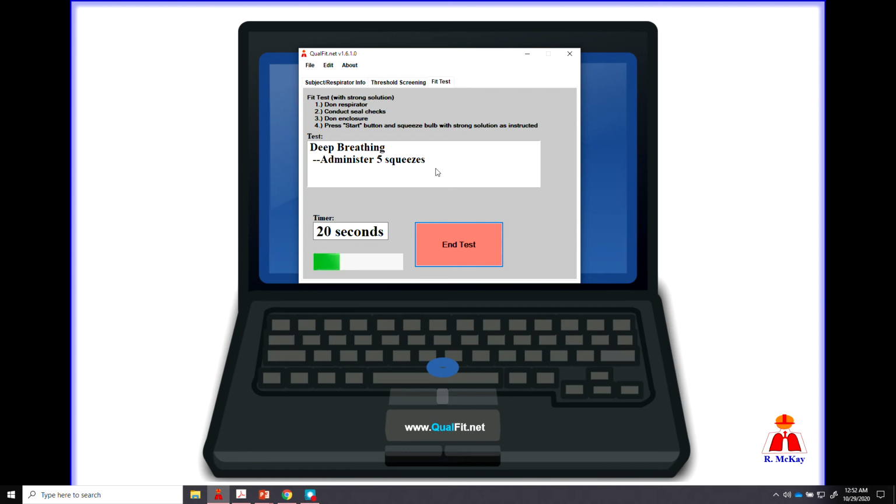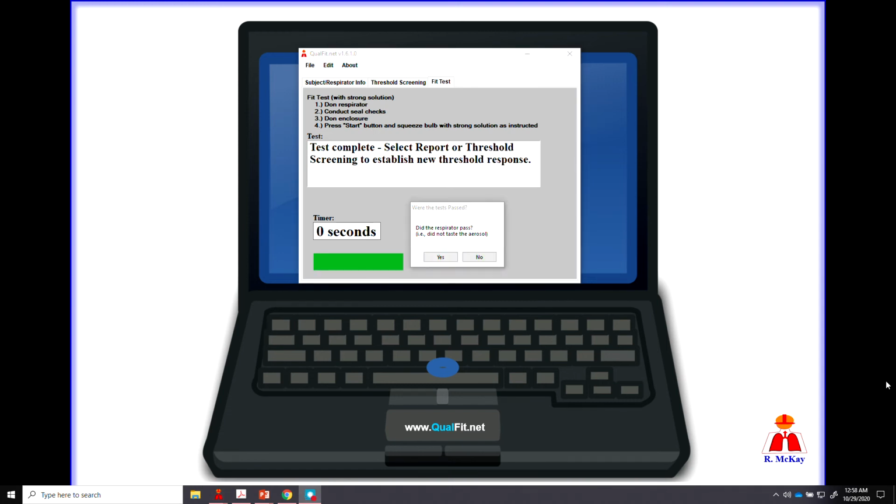To save time, I'm going to pause the video and resume at the end of the last exercise. Welcome back. While you were away, I completed the fit test, and Mr. Connor indicated he never tasted the sweet aerosol. So the respirator passed the fit test. I'll respond to the question at the center of the screen which says, did the respirator pass? And I'll select yes.